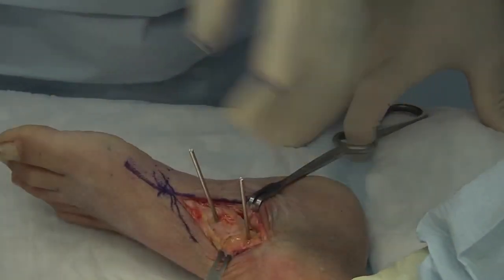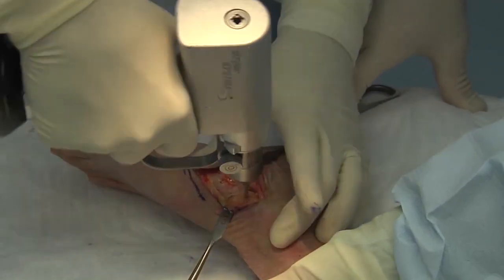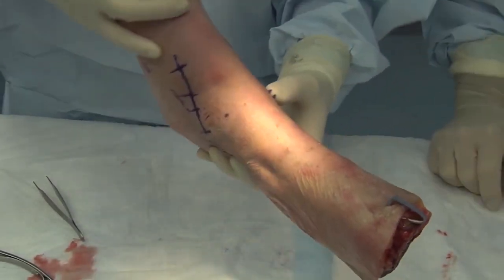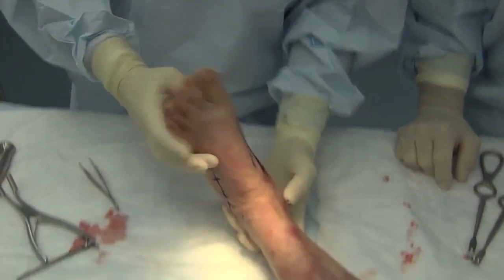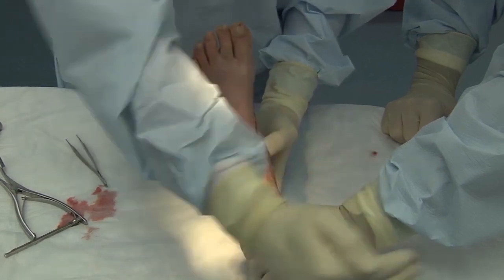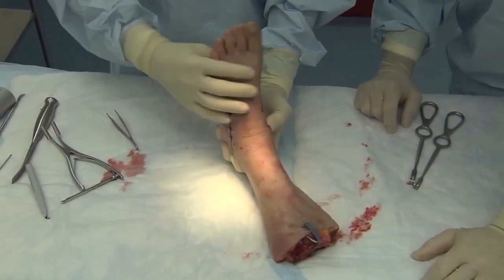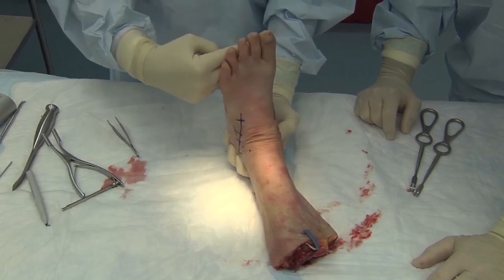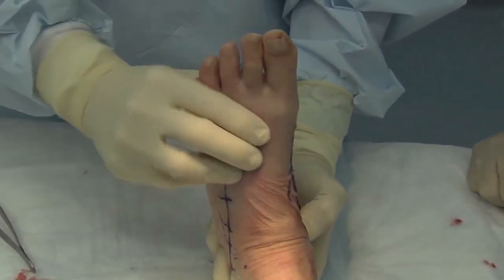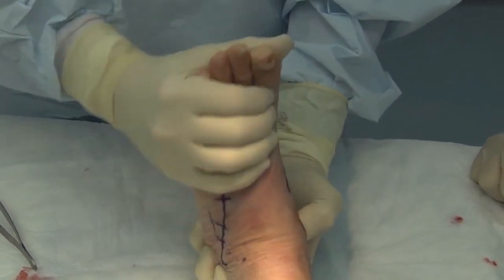After we've done that, the next order of business is to ensure a reduction. Typically when we're doing this the patient is laying like this and I'll have them on a bump, working with the foot or leg turned out. At this point I'm really focusing on where I want this joint lined up, so I will prep out the tibial tubercle so I can see the axial alignment of the leg, and I want to position that forefoot perpendicular to the axis of the tibia. It's important to understand that sometimes dorsiflexion occurs through the midtarsal joints, so you have to restore the alignment of the first ray from the talus all the way down to the first metatarsal to determine the position of reduction.